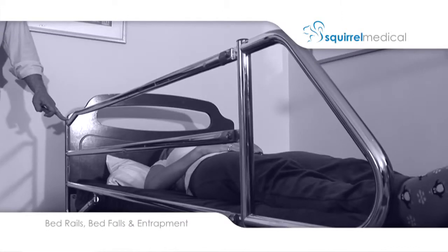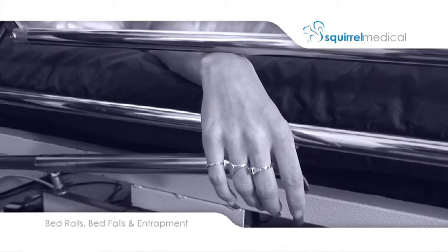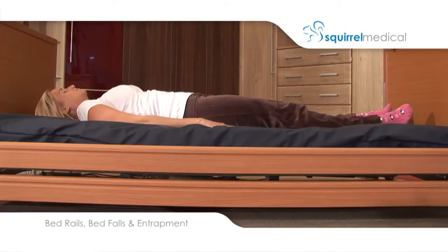Frequent maintenance of nursing beds and mattresses is essential. These scissor action bed rails have a faulty catch, which means that they may collapse with such force that limbs can be broken. It should be remembered, however, that bed rails, when used correctly, work and prevent thousands of injuries each year. Zero bed rail policies are questionable.